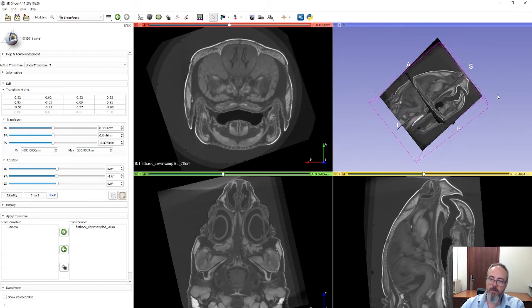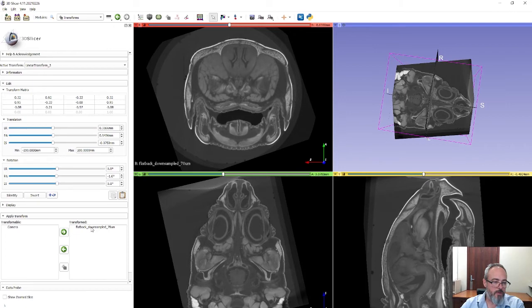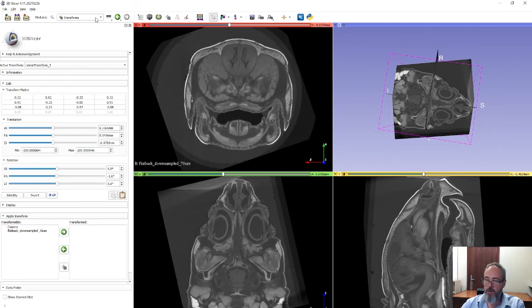Once you're happy with that new orientation, click on the transform data and click Harden Transform. The data disappears back into the transform box — this means the data is now transformed. Now we want to actually reslice it according to the new position on the grid, and to do that we're going to use a module called Resample Scalar Volume.